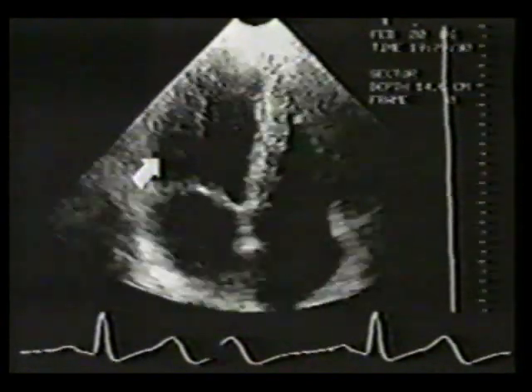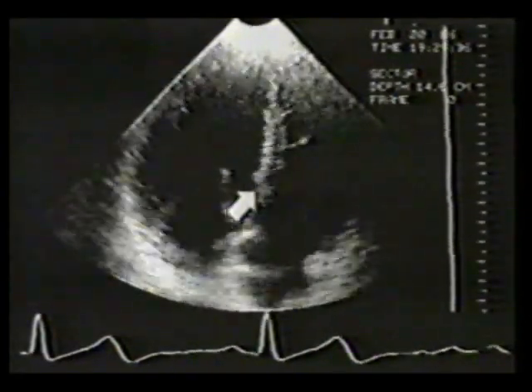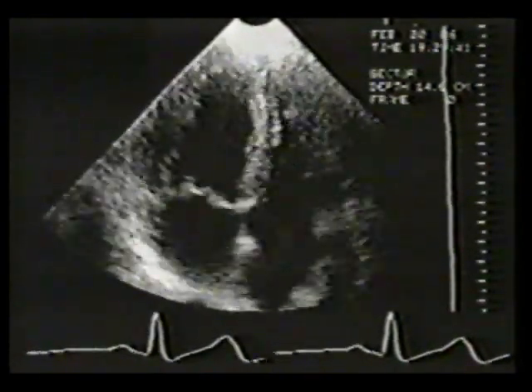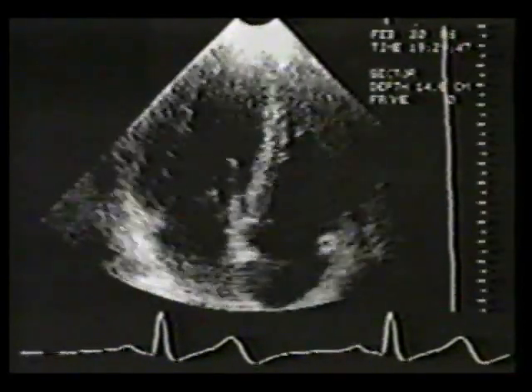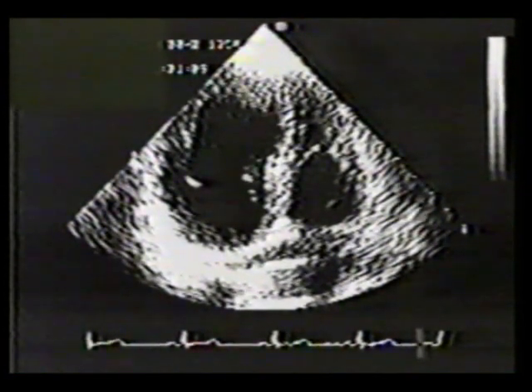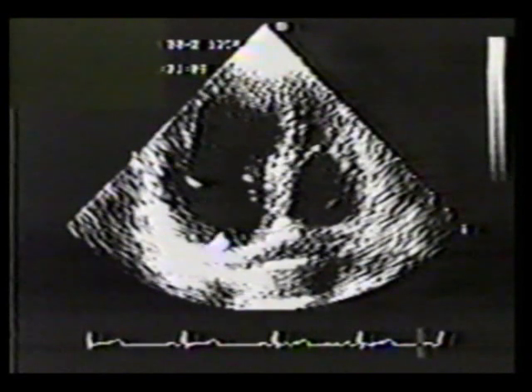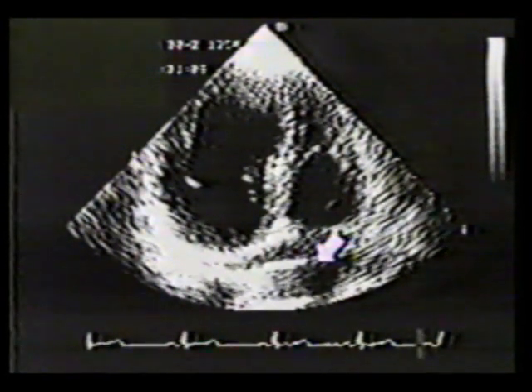In real time, note the uniform contractility of the left ventricle, and also note the normal opening and closing motions of the mitral and tricuspid valves. From the apical four-chamber view, the transducer can be tilted inferiorly to develop a long-axis view of the coronary sinus. The coronary sinus is located in the left atrioventricular groove. It empties here into the right atrium.